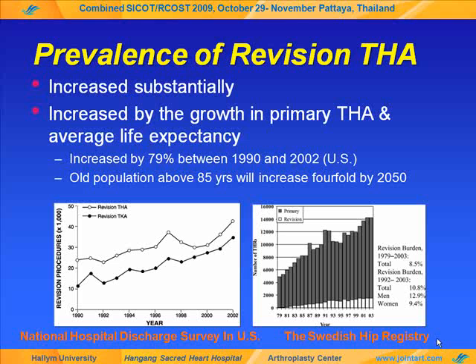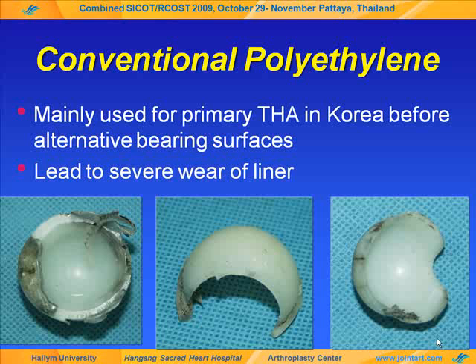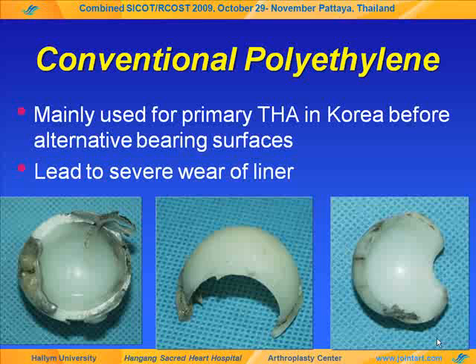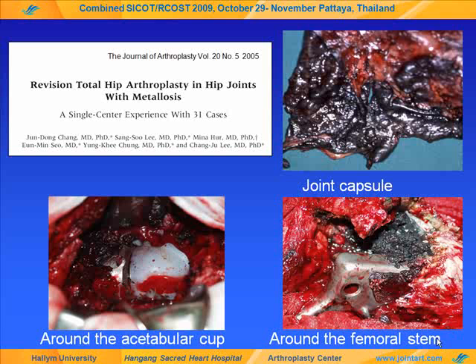The prevalence of revision total arthroplasty is substantially increasing not only worldwide, but also in Korea. Conventional ultra-high molecular weight polyethylene for the bearing surface has been mainly used in Korea since total arthroplasty began to be performed. Wear and osteolysis were particularly higher in Korea due to different lifestyle and relatively young patients compared to Western countries. We have documented this background with severe metallosis caused by impingement.